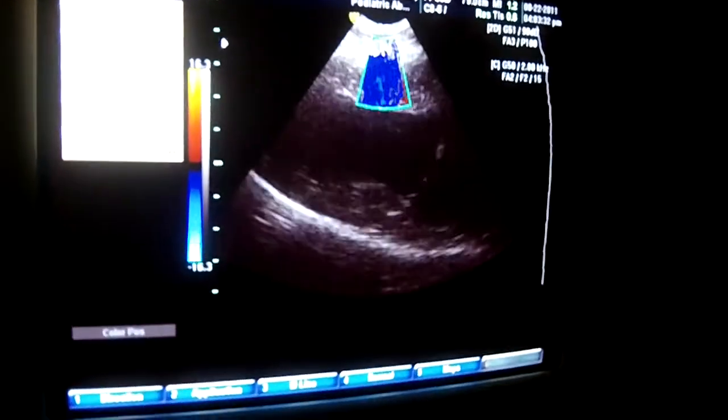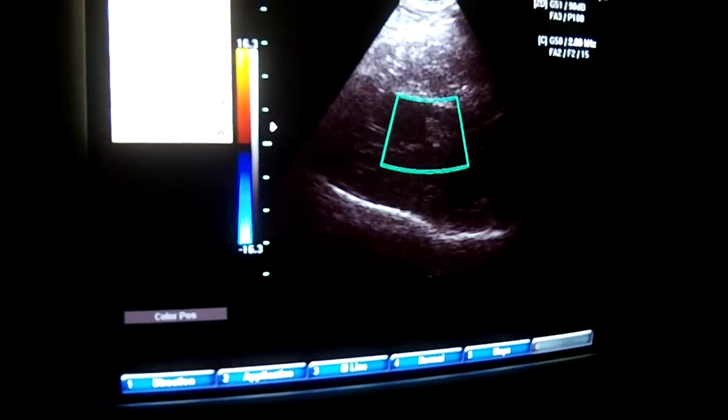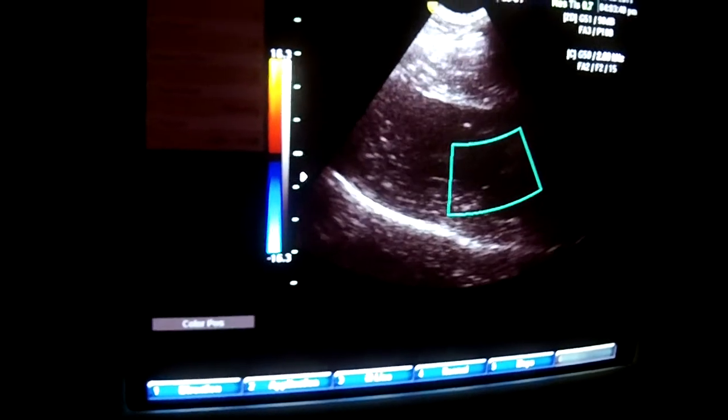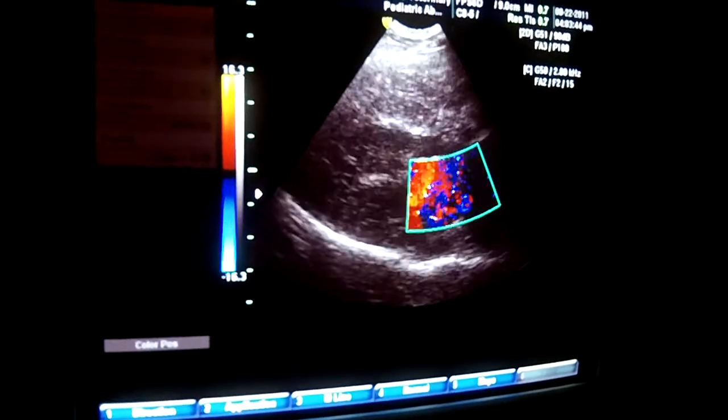Move that little square right over. Head to the right. Perfect. See those jets of white and yellow? That's high flow.